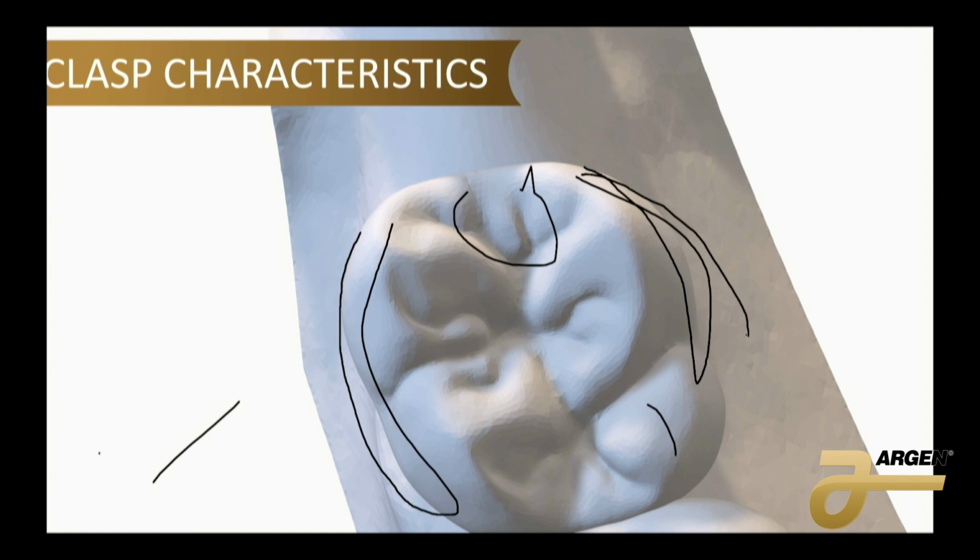So when we're pushing, it's going to stop it. That's what your reciprocating arm is for. You have to have something to reciprocate that undercut force. Otherwise, your teeth are going to get torqued, and eventually they're going to fall out, and we're going to lead to a whole denture, right?